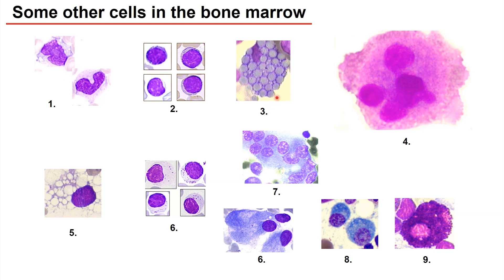Number four is the biggest cell in the bone marrow. The size is about 50 times bigger than a normal cell, very close to 100 micrometers. These cells are going to form the platelets. This is the megakaryocyte.